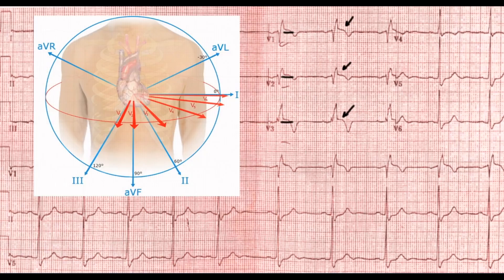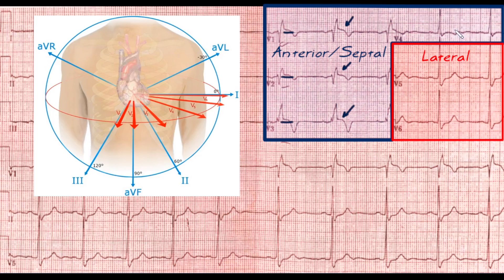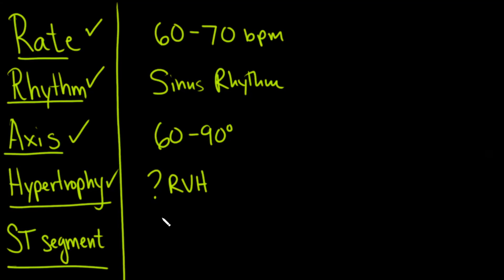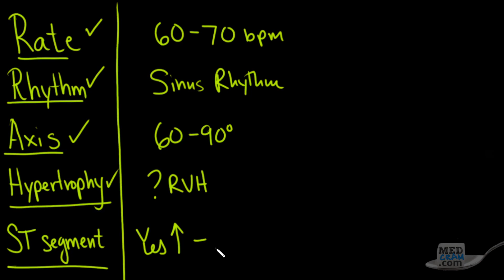Because these ST changes are in the precordial leads, we're looking at right ventricular precordial and anterior left ventricular territory. Notice we don't see them going over to the lateral leads. So the answer is yes, there is elevation consistent with a ST segment elevation myocardial infarction.